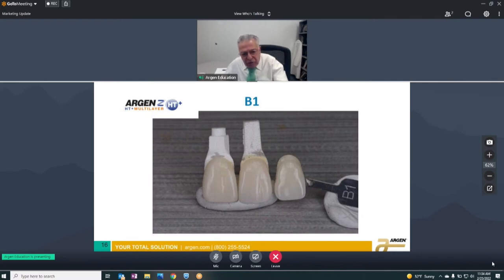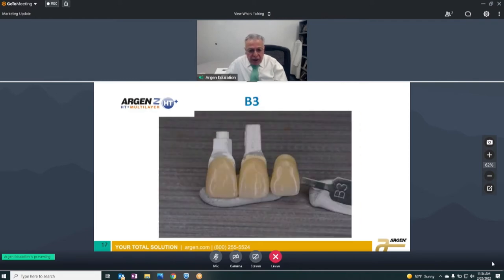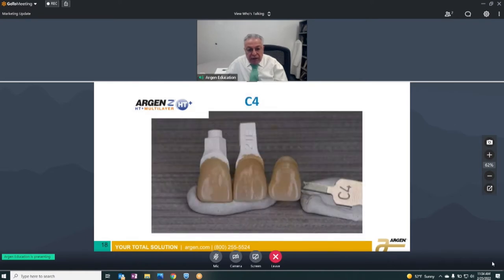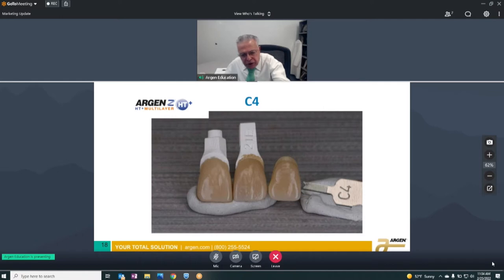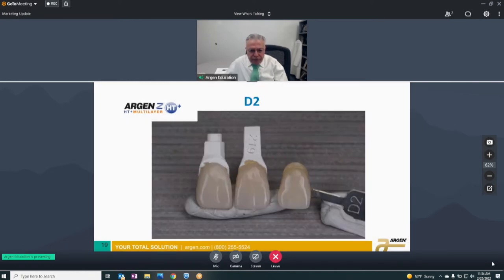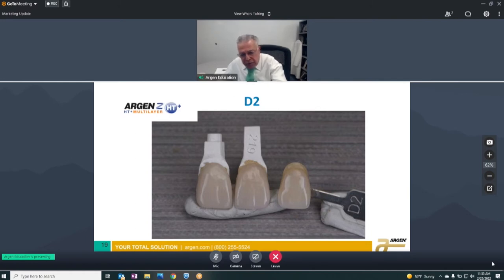B1 shows the same variation in chroma and translucency, with a much better match to the shade guide. Even B3 and C4 — very dark shades — show the chroma at the gingival coming out much closer to the shade guide than you could achieve with a single pre-shaded blend. D2 is a very difficult shade because the D2 neck has so much chroma, but with the multi-layer we're able to duplicate that and pick up nuances of the shade guide very closely.